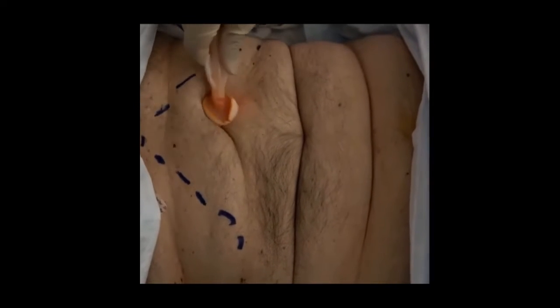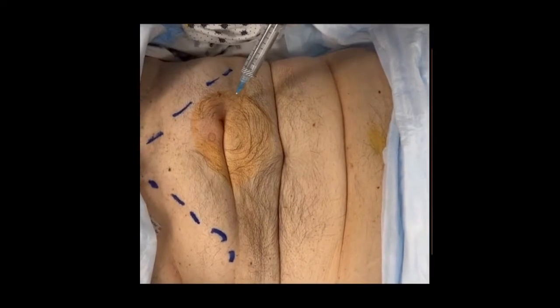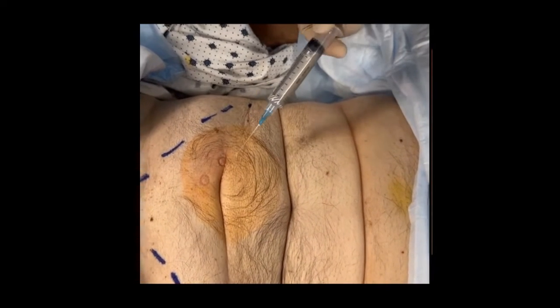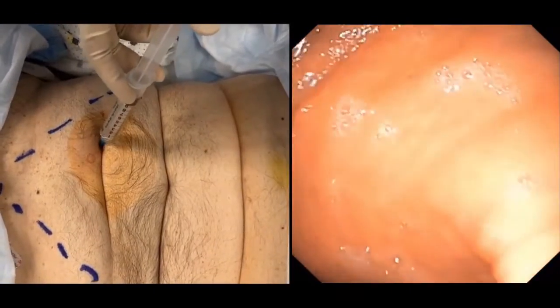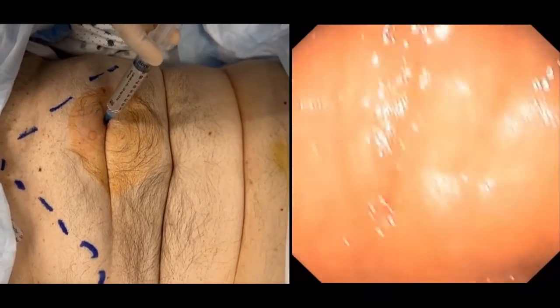Disinfecting the area is done using alcohol and a chlorhexidine-based sterile stick. We then inject lidocaine subcutaneously at the tube insertion site to make it less painful. As we can see, the needle is seen inside the stomach and the whole track is being injected with lidocaine.